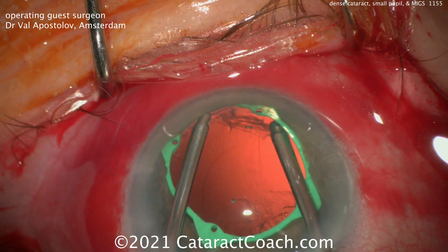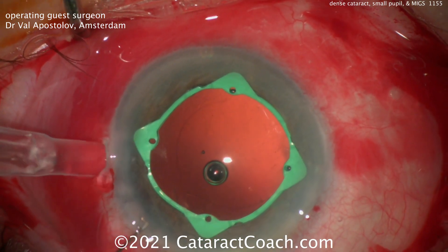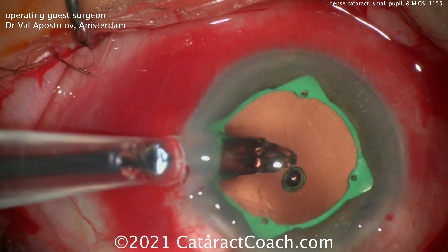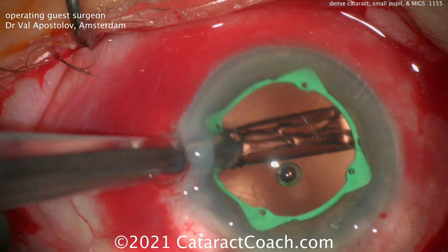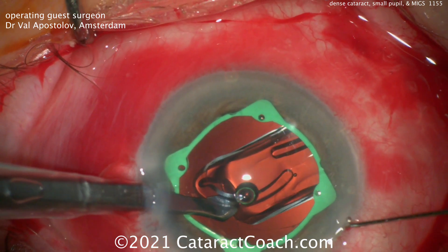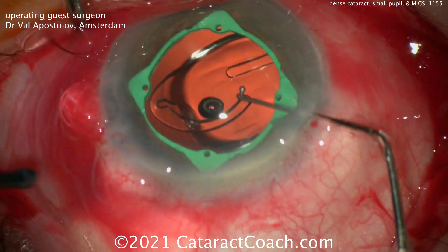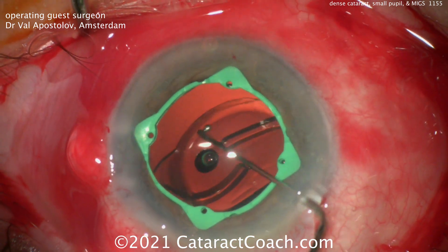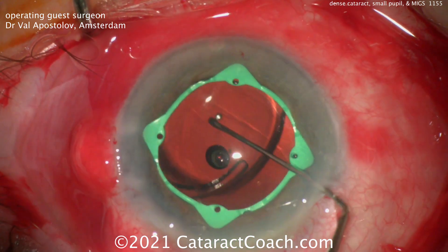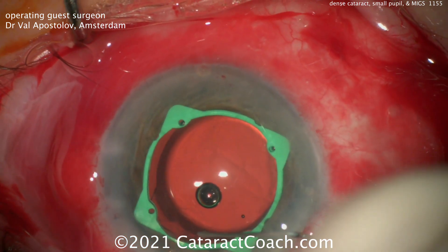Notice how he can move the ring around to get better exposure in order to get all the cortex removed with the bimanual IA. That's a very slick move — using the infusion hand to push the ring around to get good access. Now here comes the IOL, going right in the capsular bag. Looks like there was sufficient capsular and zonular support to do the cortex removal without needing a capsular tension ring. There's that lens going in the capsular bag. Looks like a single-piece acrylic lens, perhaps a Tecnis ZCB00.